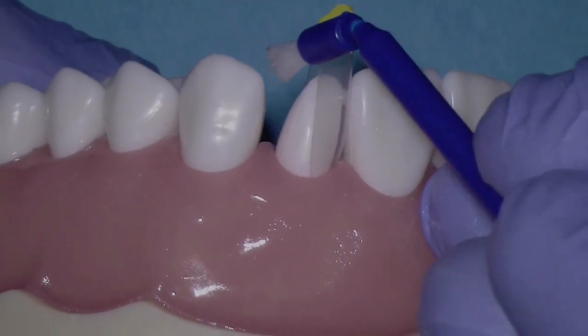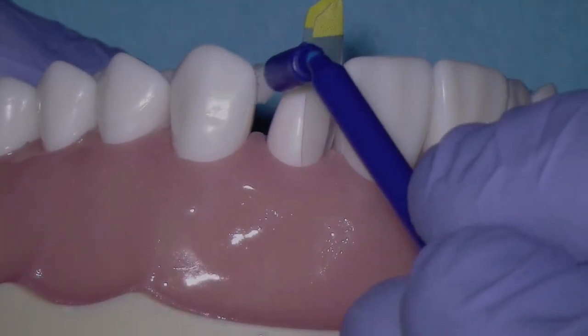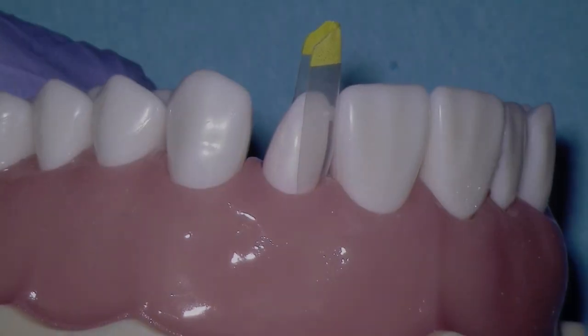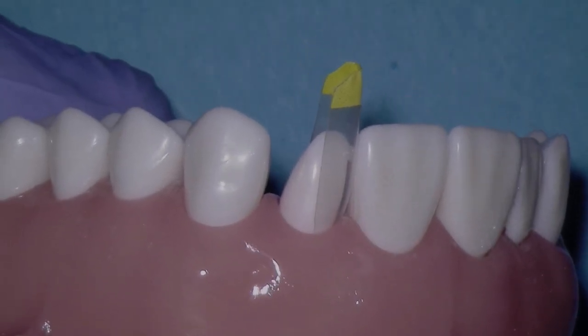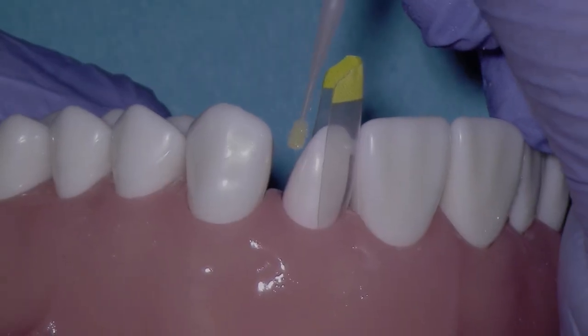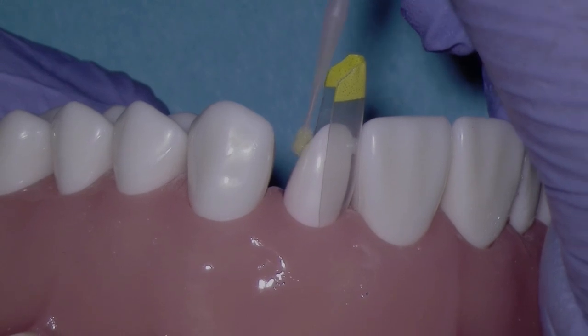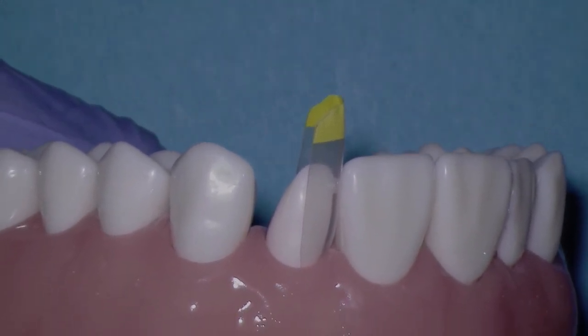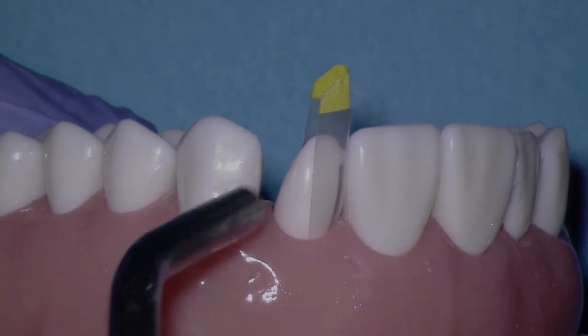We'll come in here on the canine with our lubricant, put just a small amount on the mesial of the canine, and we'll air thin that. Now we'll come in with the Scotch-Bond Universal Plus and apply adhesive to our contact area on the peg lateral, which will be approximately here. We want to use a very small amount of the adhesive. Next, we're going to air thin, and then we'll bring in our cold flowable composite.